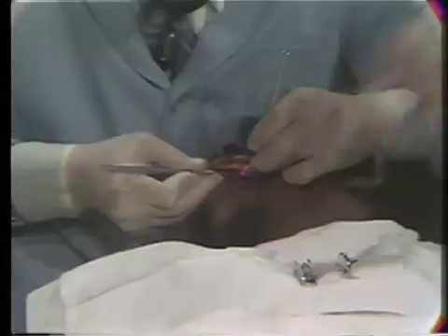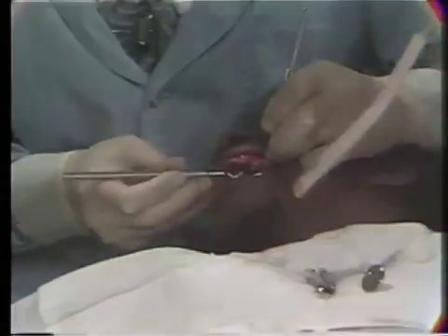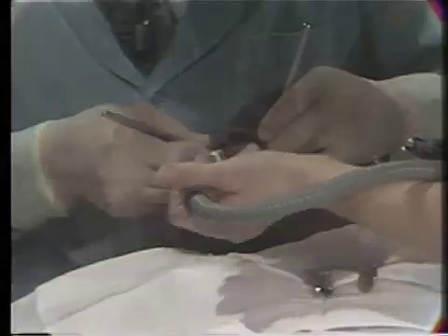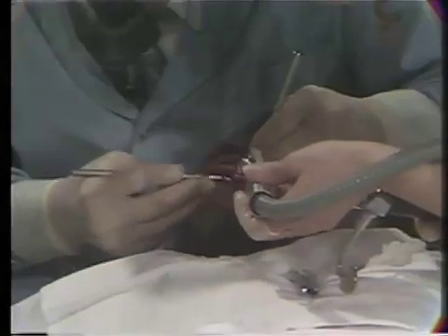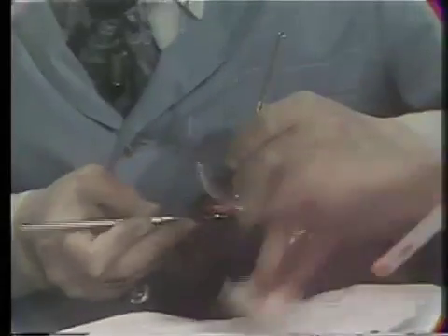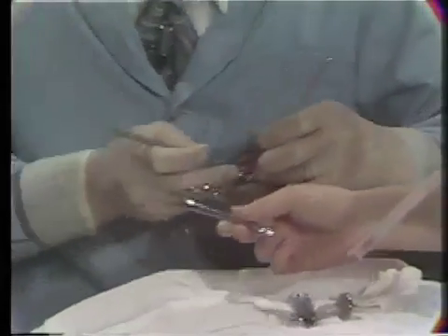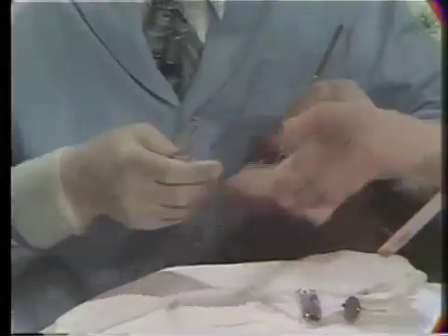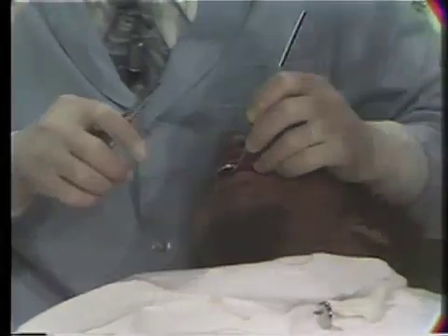Hi, everybody. Back to right. I've double checked, and I'm satisfied with everything. All right, back forward here. So we have the suture ready now. And hold that up away from his beard down there, Betty. Yeah, that's it.